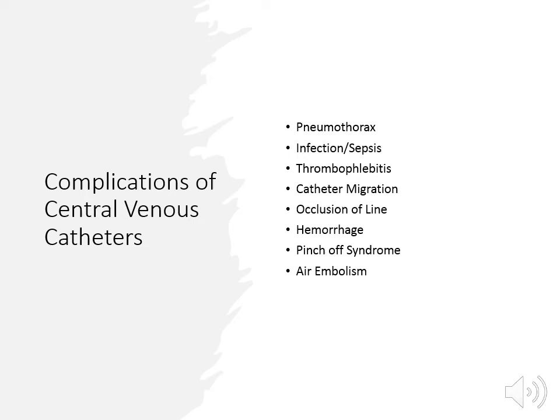Air embolism. When air enters the veins and gets into the right ventricle, it lodges against the pulmonary valve and blocks the flow of the blood from the ventricle into the pulmonary arteries. This can occur during insertion or when caps on tubing are changed. Signs and symptoms: dyspnea, tachypnea, lightheadedness, tachycardia, hypotension, confusion, cyanosis, chest, shoulder, or low back pain.